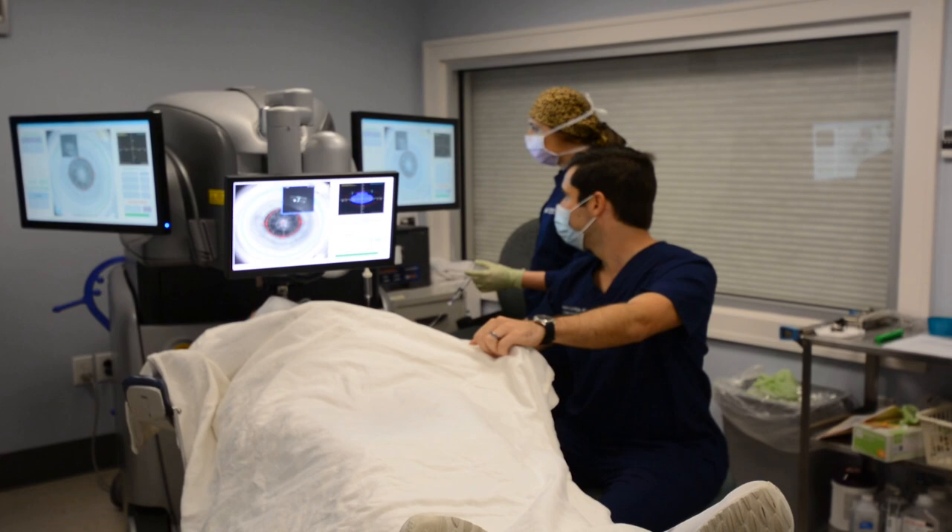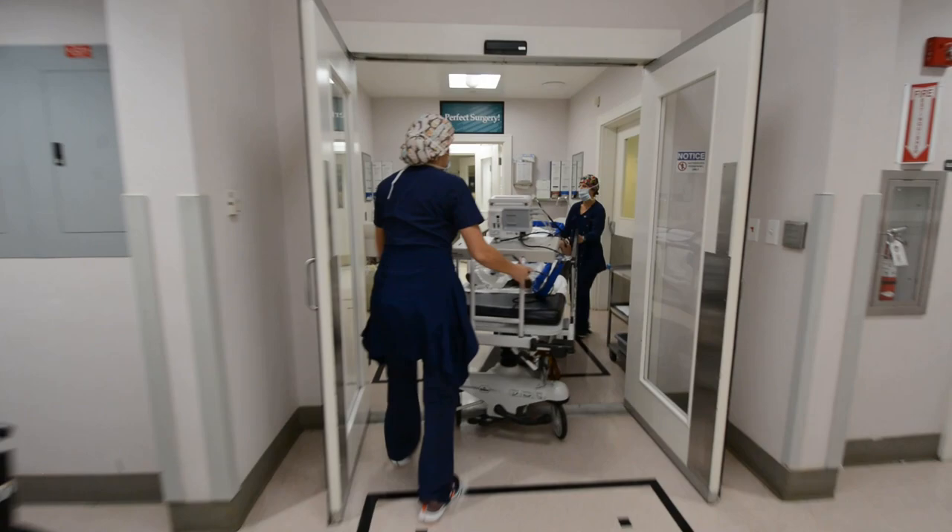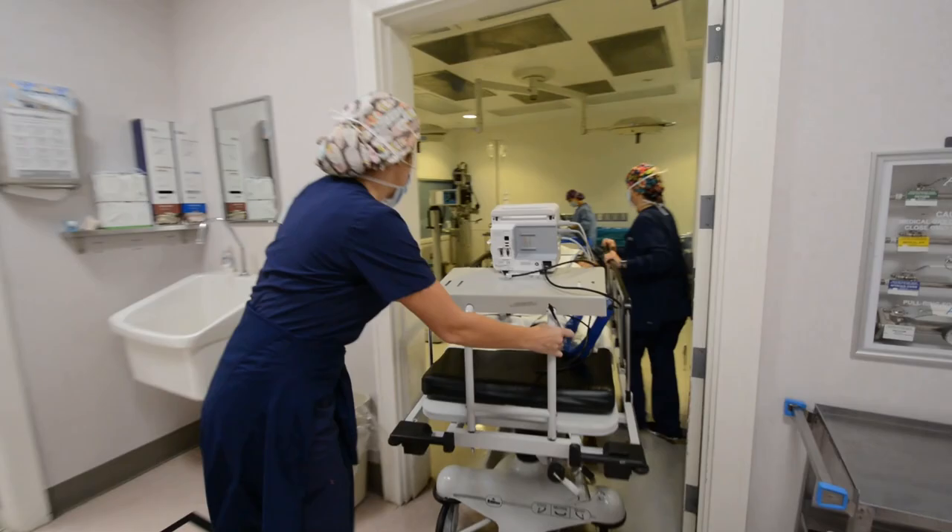Your experience with us begins in the laser room where we use the LensR system, the most advanced laser cataract system available, to break up your lens, gain access into the lens, and also correct any astigmatism.